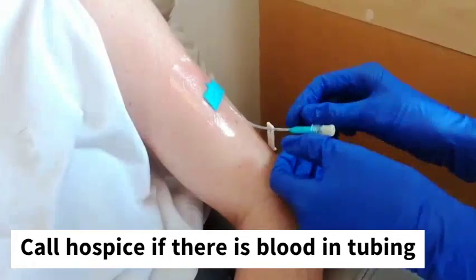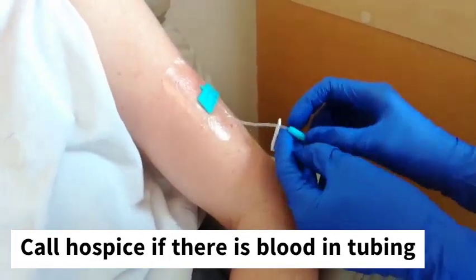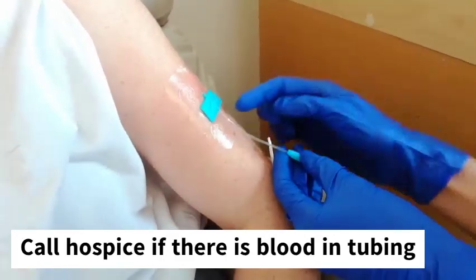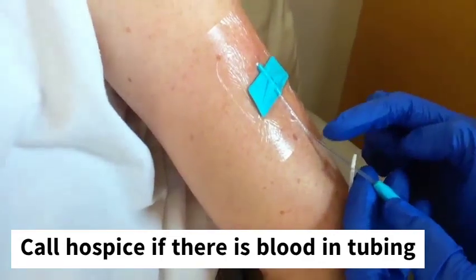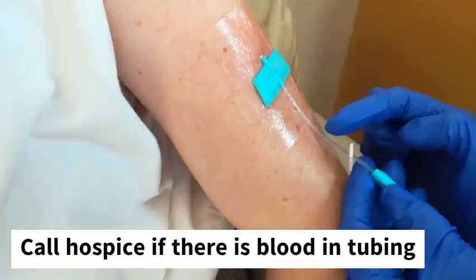Now we need to check in here, in this middle section where the flexible tubing is, to make sure there's no blood. If there's blood, we'd like you to call the hospice and ask for some advice.